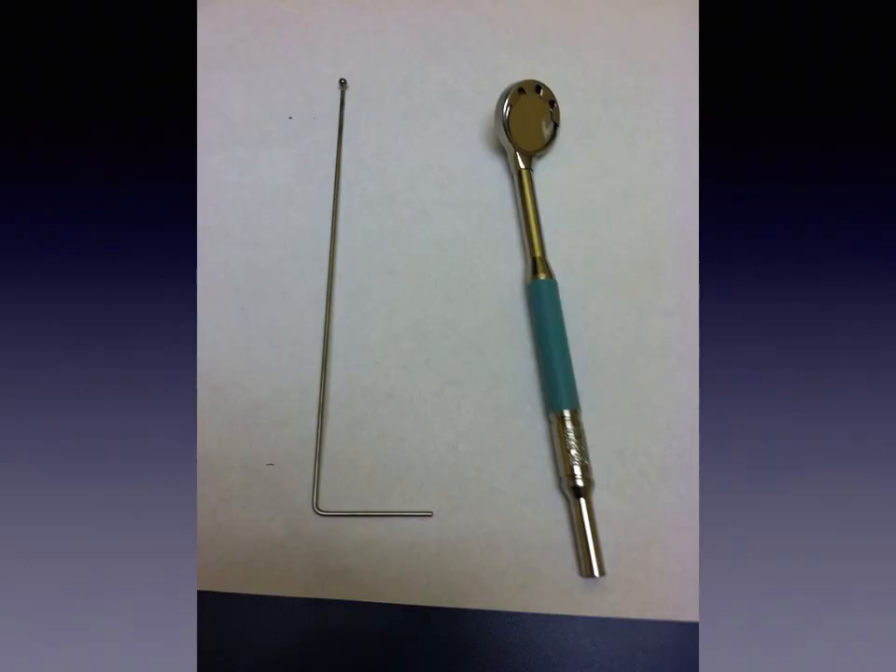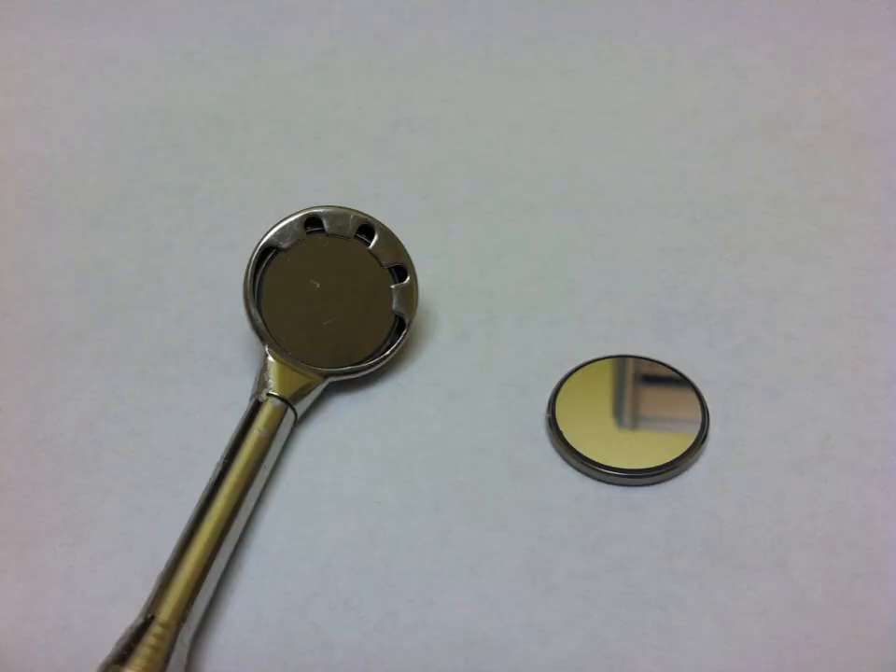I want to show you the New Bird suction mirror's mirror face change feature. The mirror face can be swapped out using a little key — I'm going to show you a video of that. Here's a closer picture of the piece you'll replace. The main reason to replace it is that the mirror face gets scratched up over time. I know people might balk at the $199 price, but it's a long-term investment. Replacement faces are about $6 each, sold by the dozen for $72.